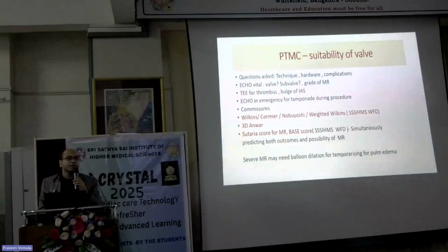Second thing is, when you do a PTMC, are you safe? Never do a procedure without checking; all this is your responsibility as techs. When you are seeing it, is there a thrombus? It might form later, it might form in the next 1 week while you are waiting for the PTMC. But when you are seeing it, number one is, are you going to be making it safe?